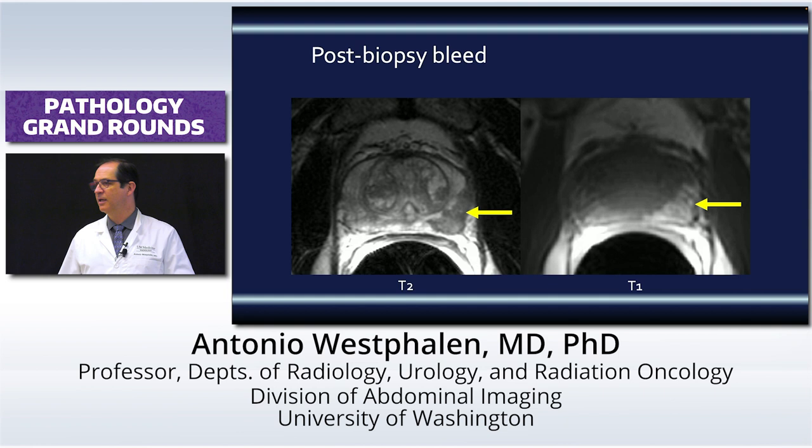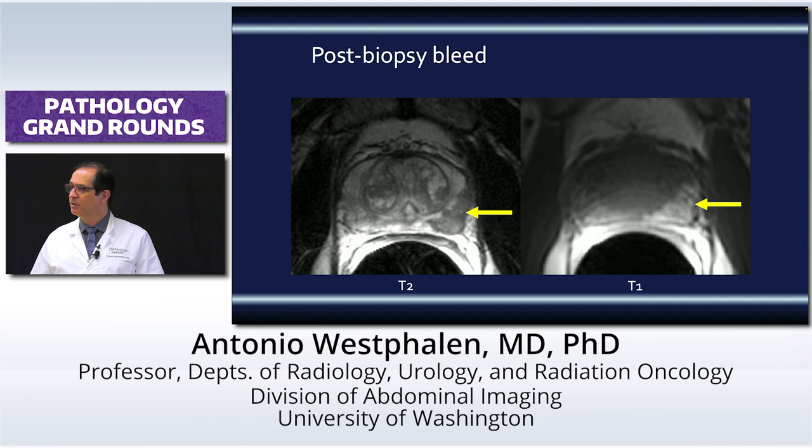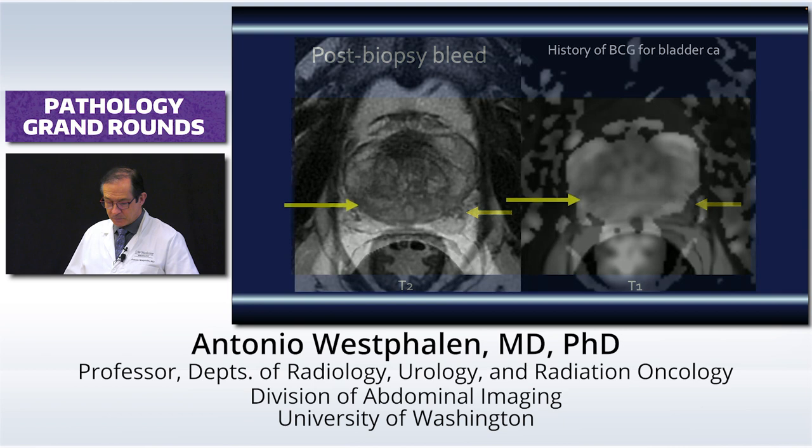Again, this was post-biopsy hemorrhage, and that's one of the reasons why, especially in the past, we would say, okay, don't acquire MR if you had a biopsy less than 2 weeks ago. Wait at least 4 weeks, 6 to 8 weeks, even better. We still do that. We still try to do it, but I think people got used to it, and we don't have those cases coming up as often. But then hemorrhage is not the only reason why we can have discrepancies.